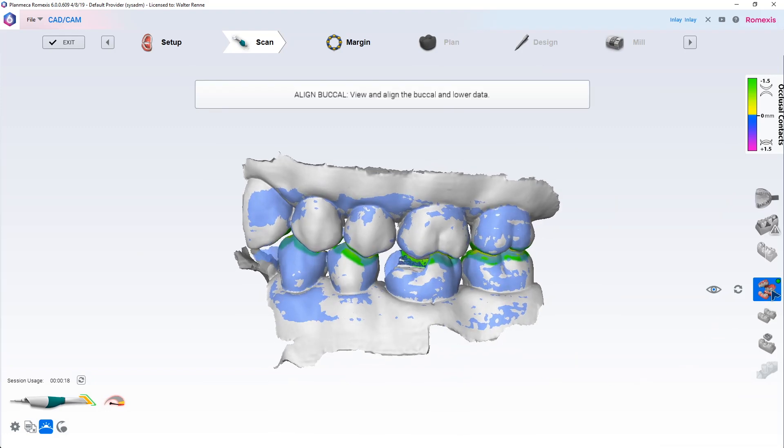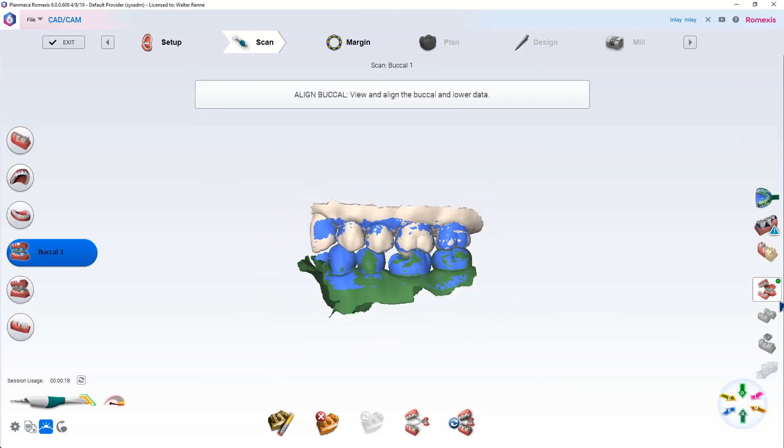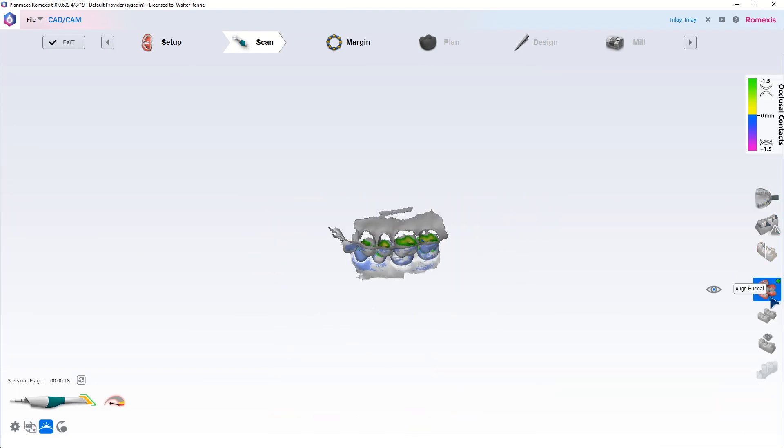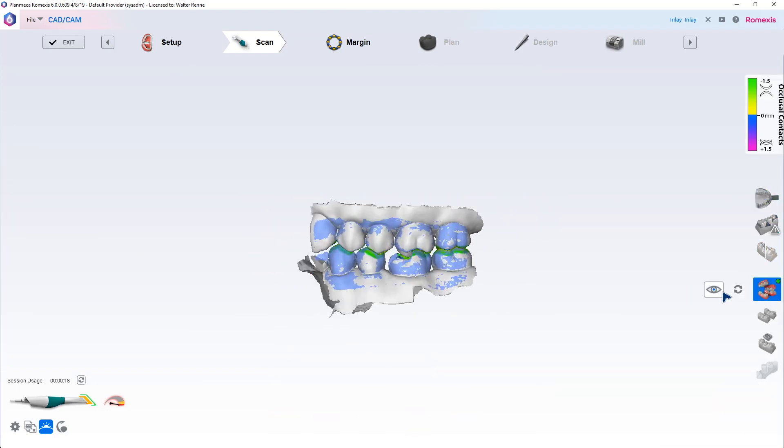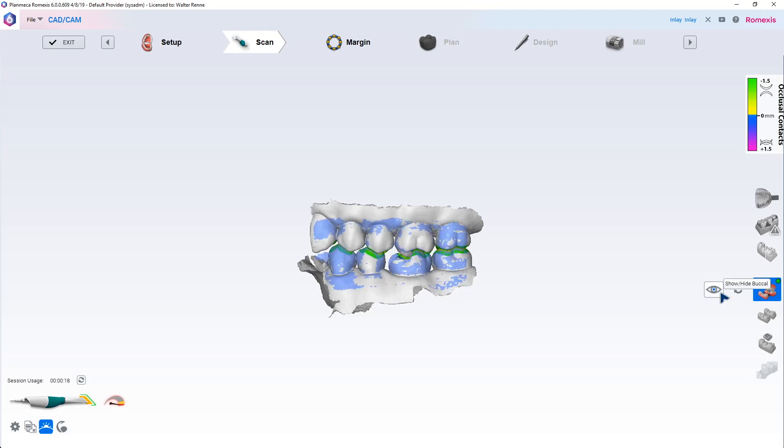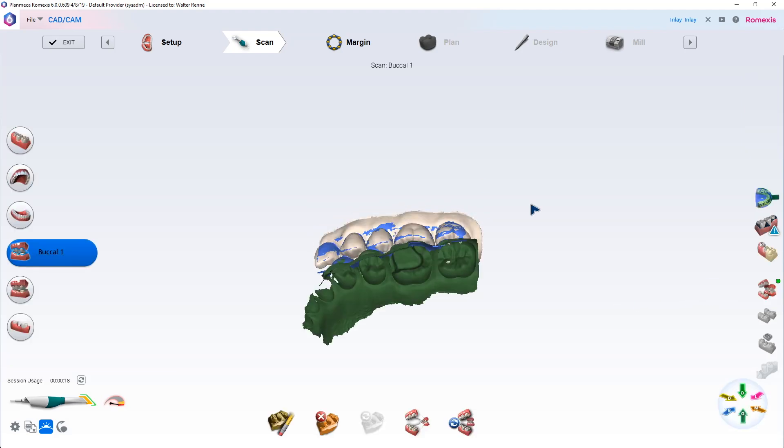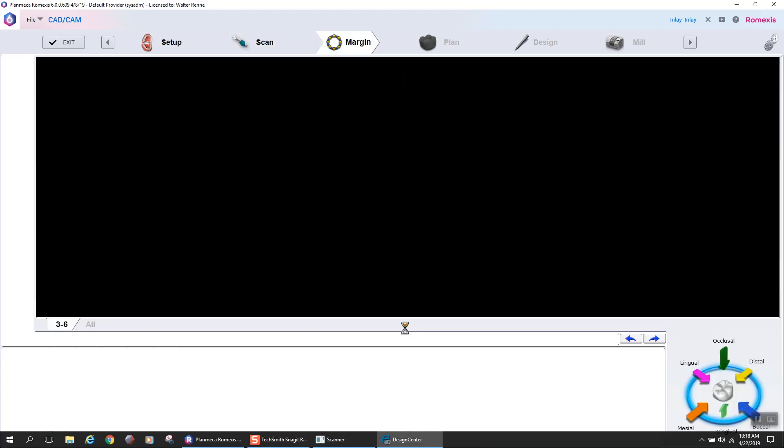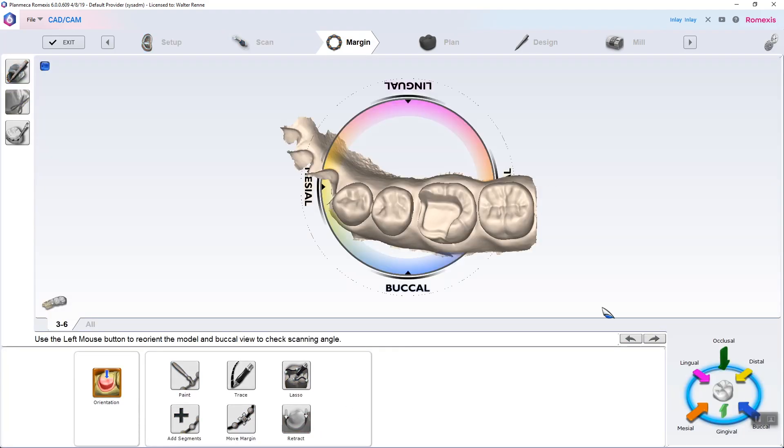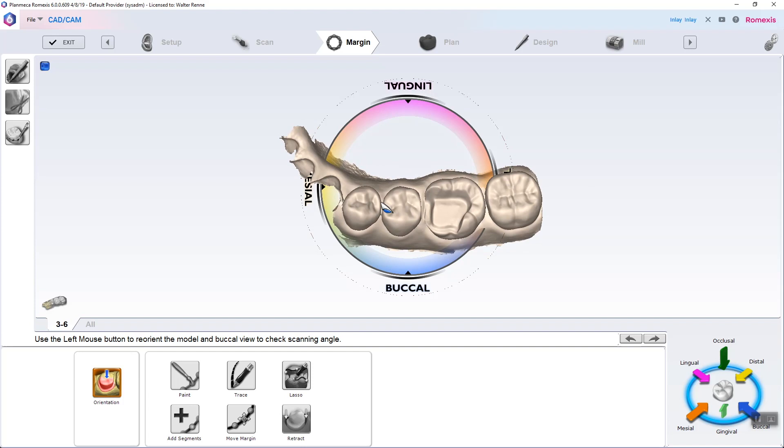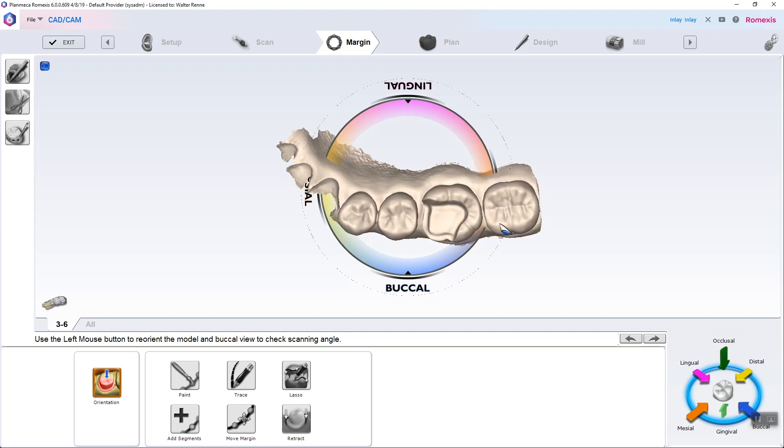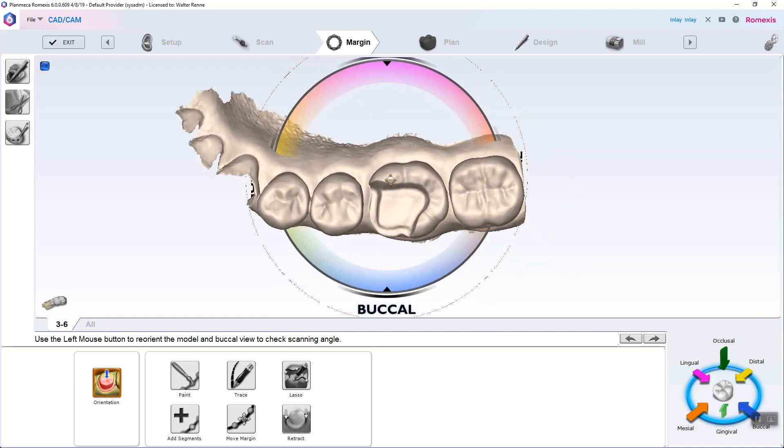If you were concerned about the accuracy of articulation, you can go into the actual bite tab and look at the actual measurements and distances between the teeth and see if there's any over-articulation or anything like that. You could even pre-mark the teeth with ribbon paper before you scan, and you will be able to hopefully see those scans.